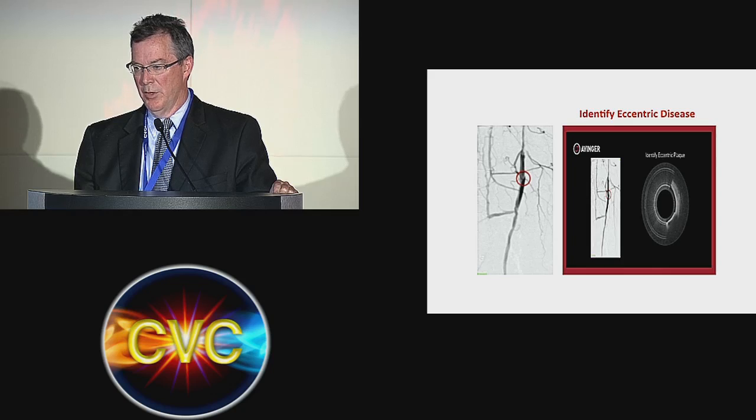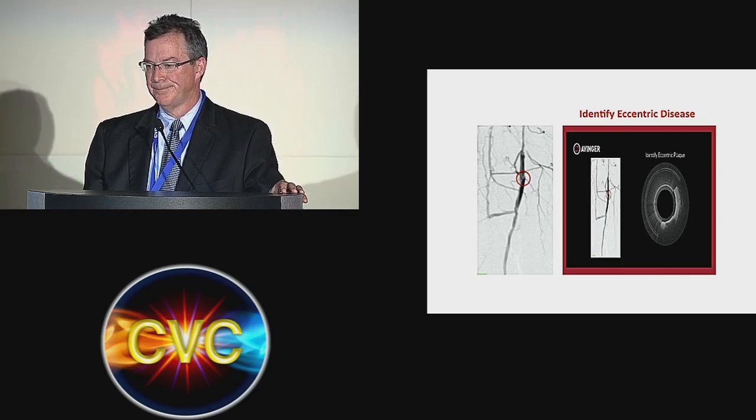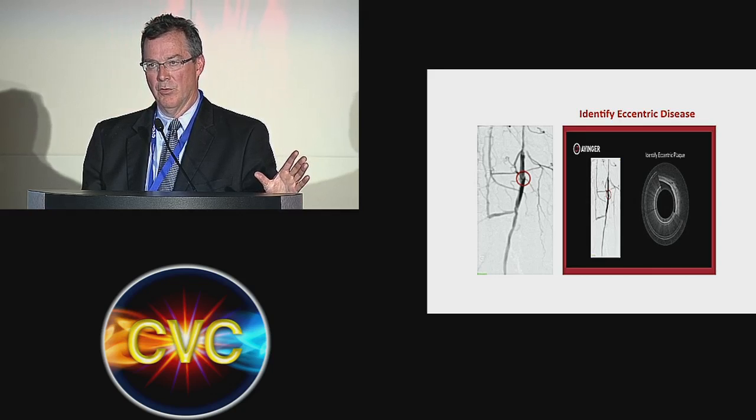Now the cutter's opened up, and you're pushing the catheter in and cutting debris. As you advance it, you can see as you're cutting through here, up there you see layered structures where you're going to stop cutting. So that's the whole concept of it. You don't want to hit the normal peripheral portion of the vessel.